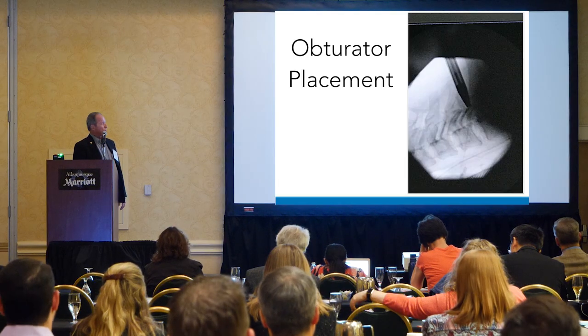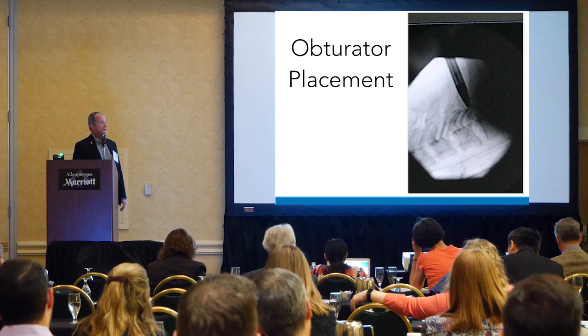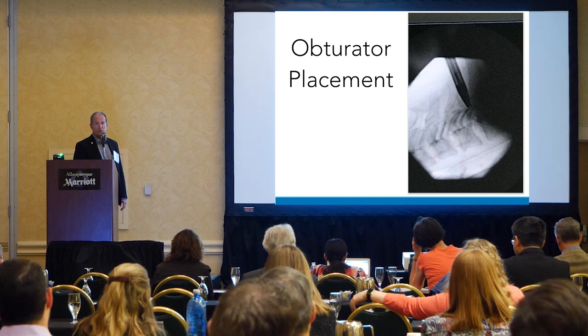So here's the obturator placement. As you can see, we're just at the bottom end of the disc space at 6-7, and we're really parallel to the disc space.